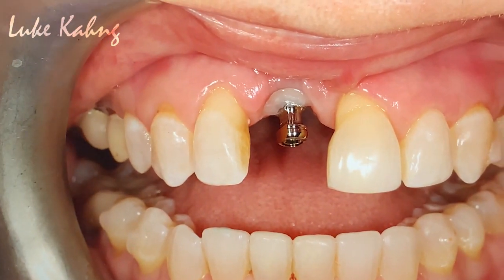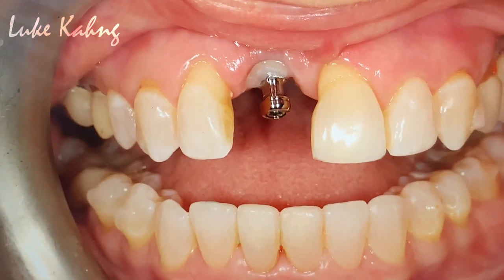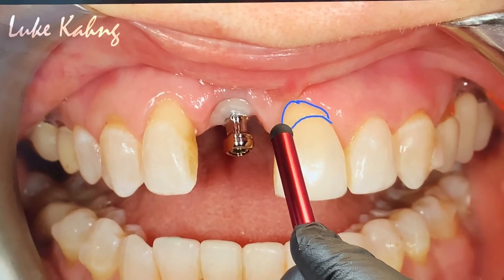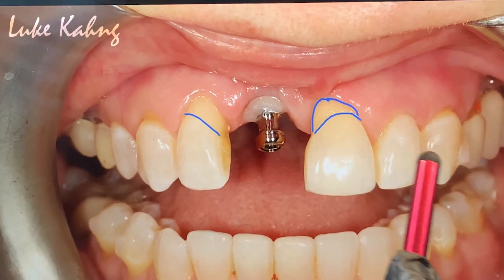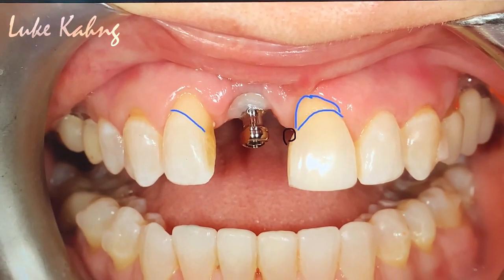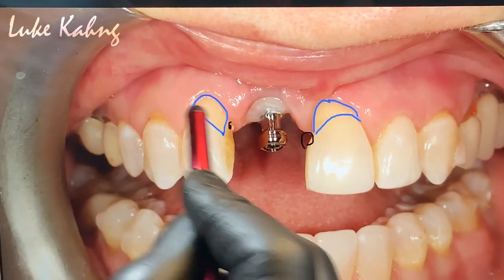And then we can use another single crown on the top. The other problem is the black triangle here, trying to get rid of this as close as possible from the pink porcelain.